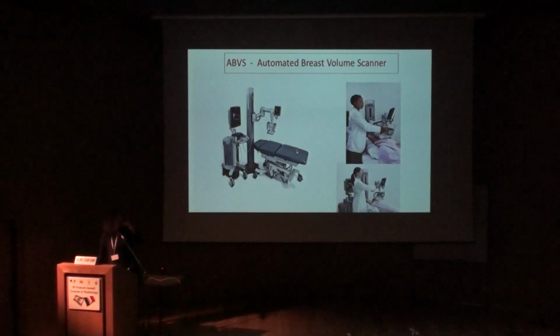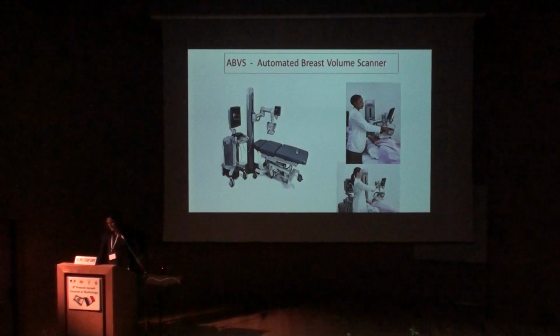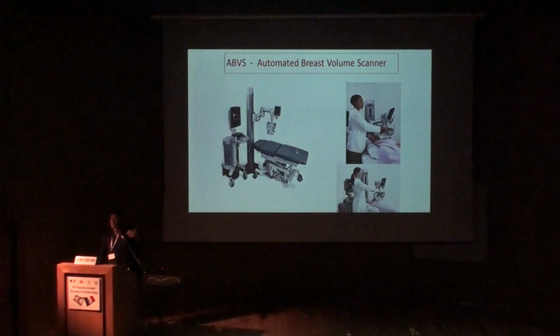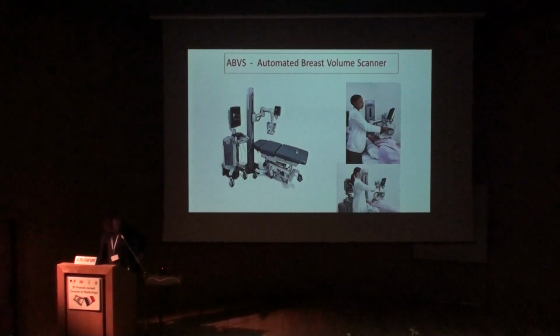Another development in ultrasound breast imaging is the automated breast volumetric scan, which is an ultrasound. Since we are doing breast ultrasound very frequently in women with dense breasts, for example, in our unit almost 60-70% of the women are doing breast ultrasound in addition to the mammography due to the dense breast, so it is very intense, and the physicians are doing the ultrasound in our unit. In some places those are technicians, but in order to overcome the load, an automatic breast ultrasound was developed.